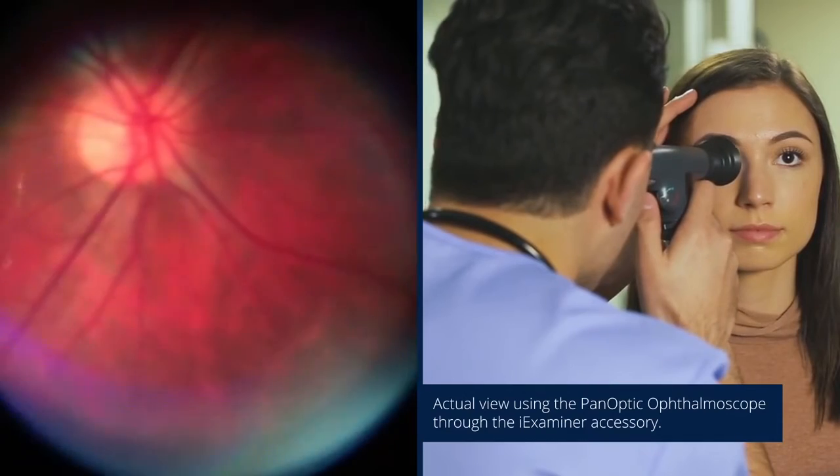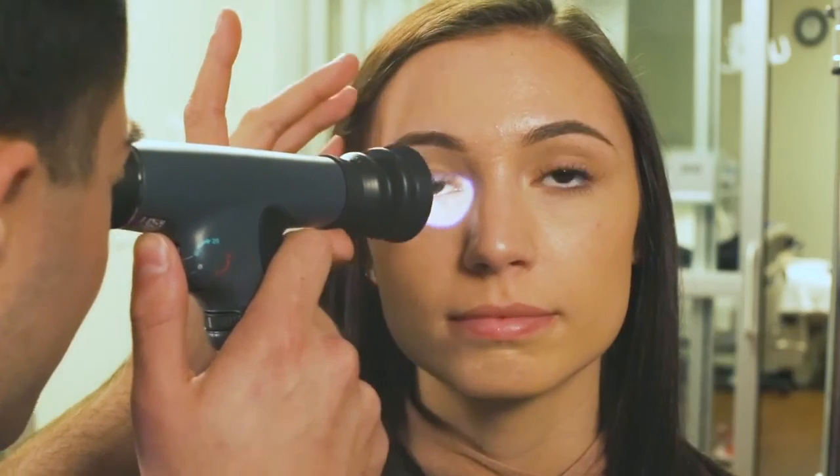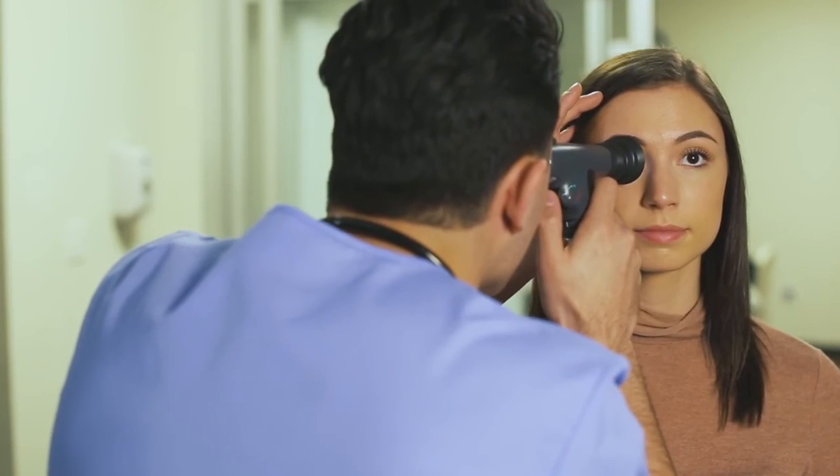Move to about 1 inch from the patient or until the eye cup touches the patient. At this point, the optic disc and surrounding vessels should be visible. If you lose the image, pull back until you see the red reflex again, then start back in.